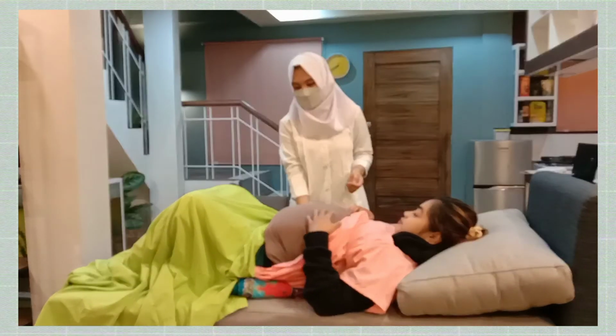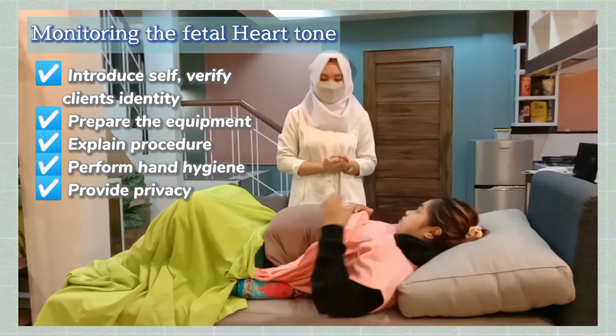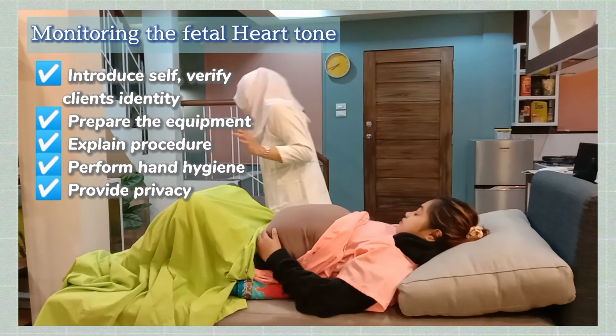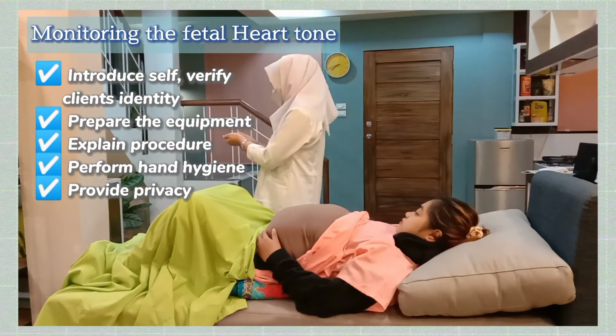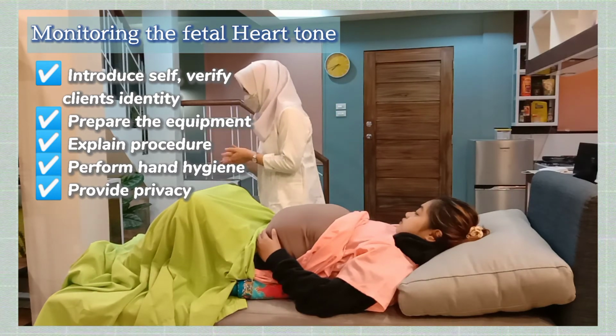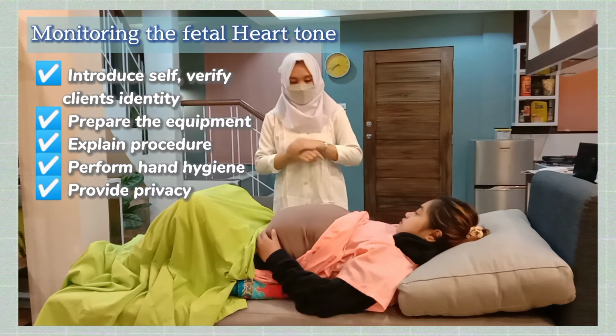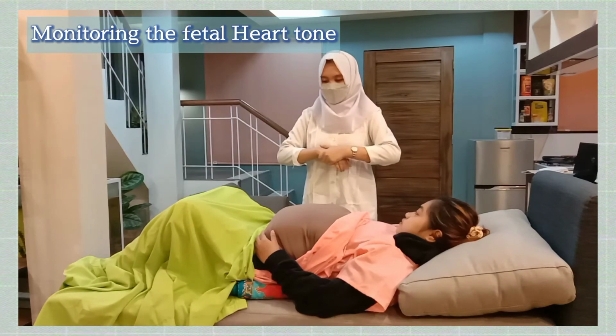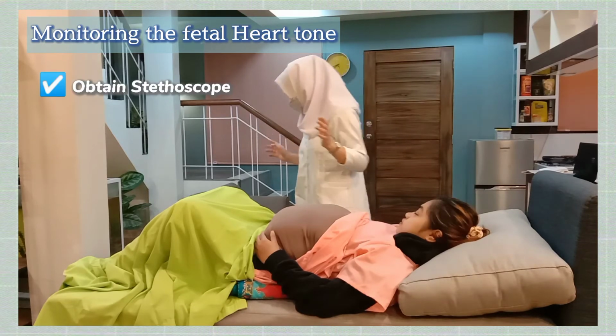Now I will proceed with monitoring the fetal heart tone. Let me perform hand hygiene again first. I will be monitoring the fetal heart tone to know the condition of the baby. Okay, I will get now the stethoscope.